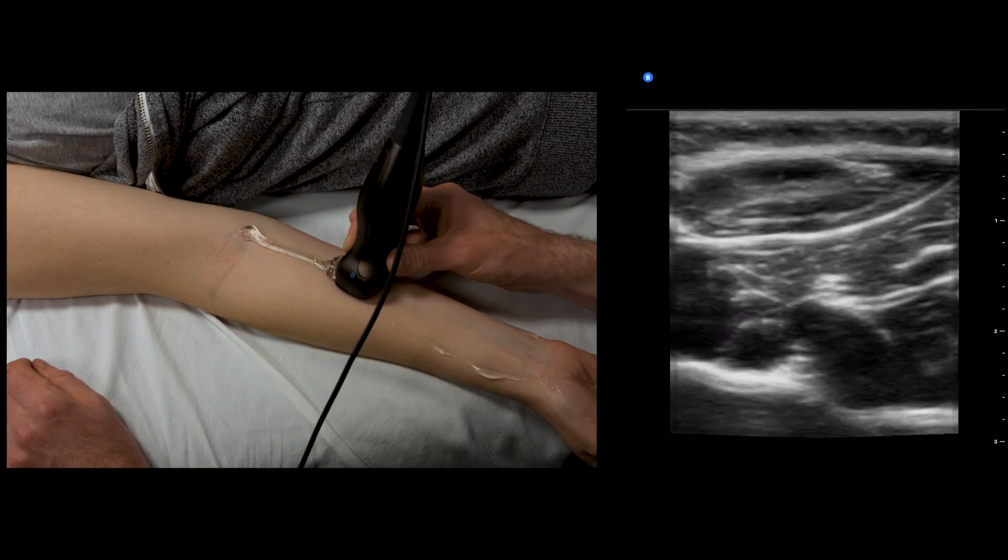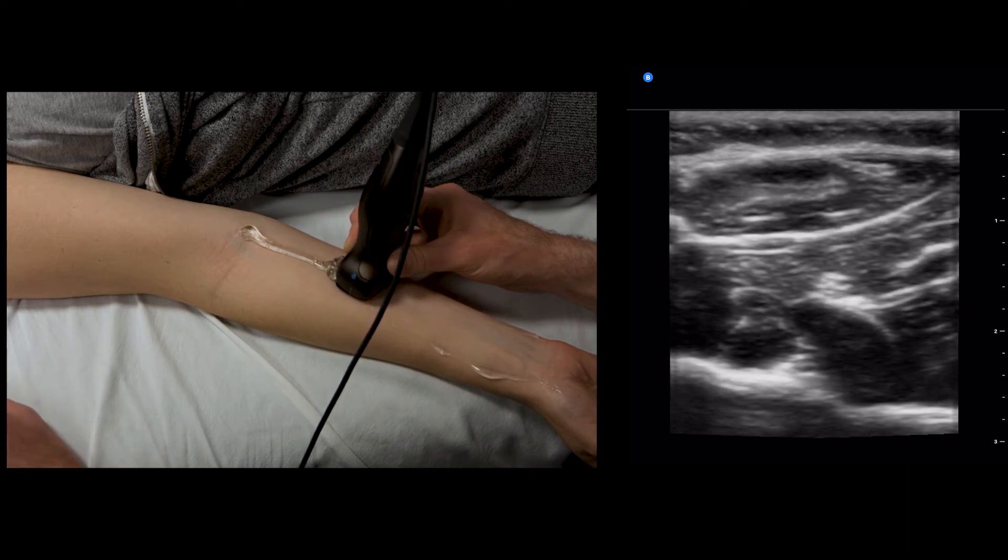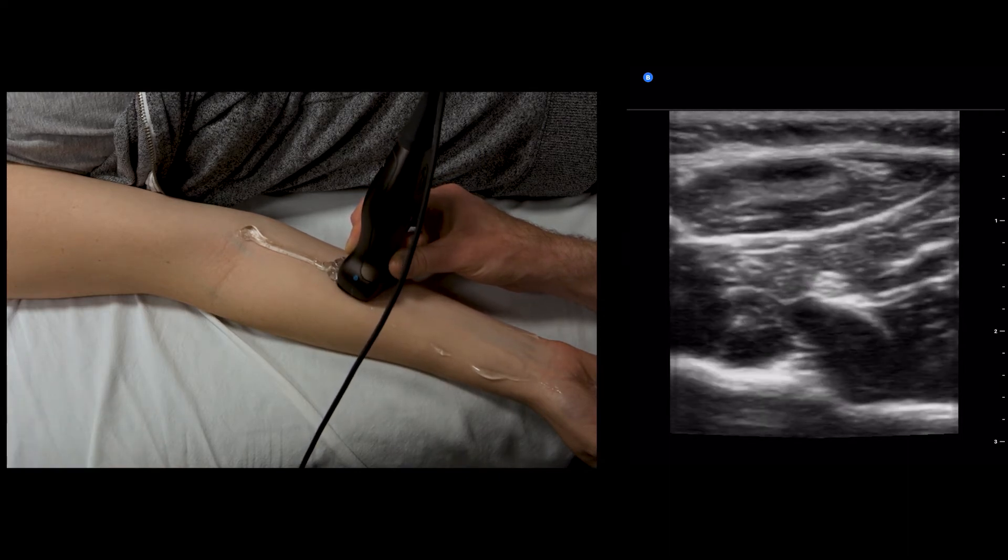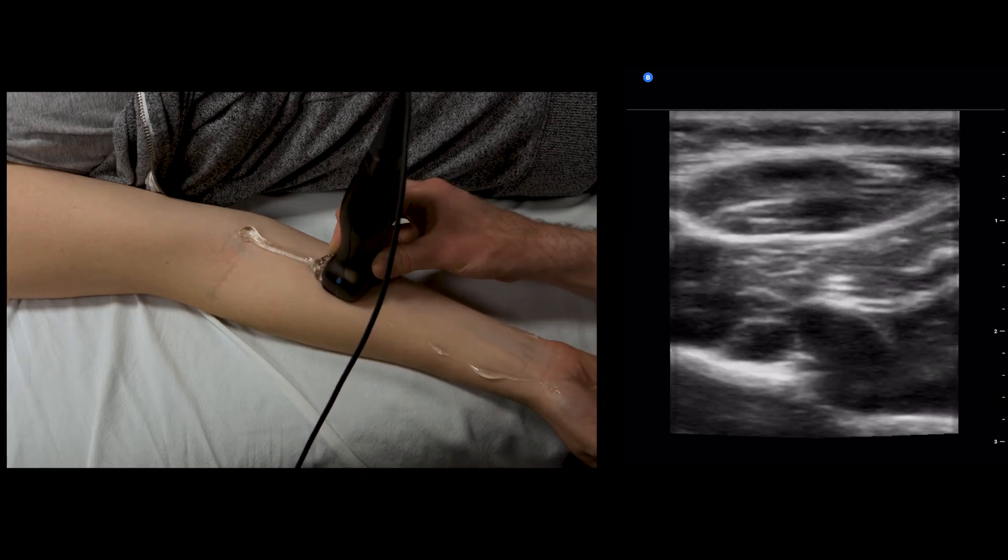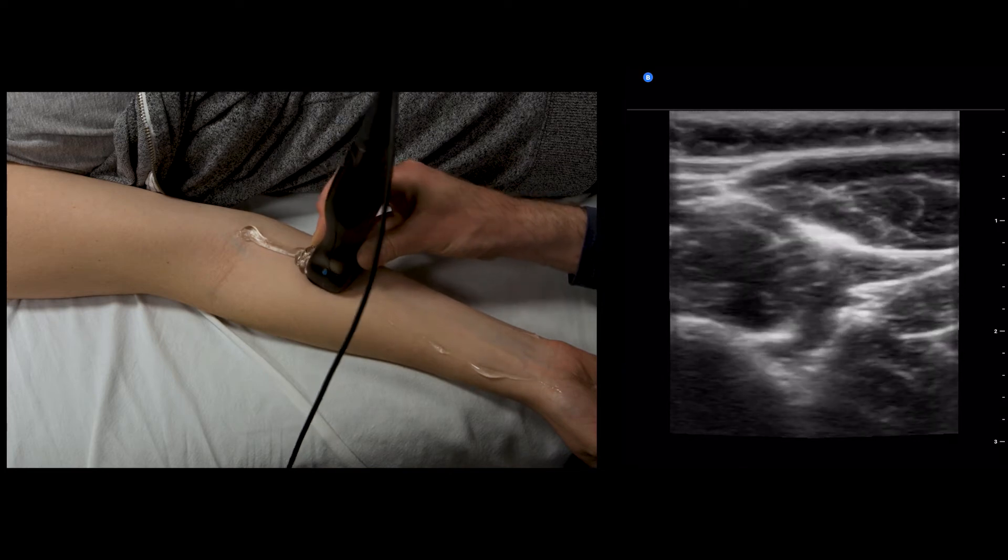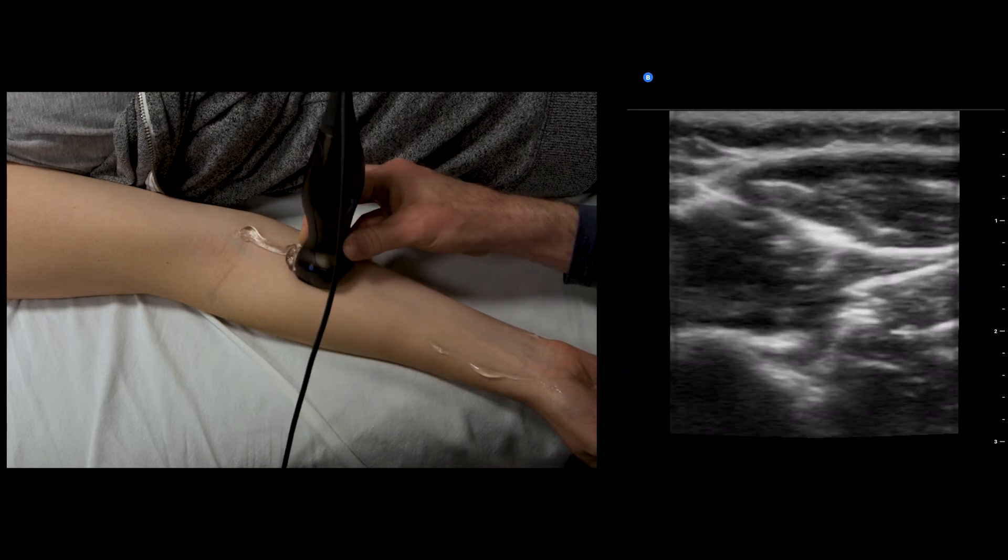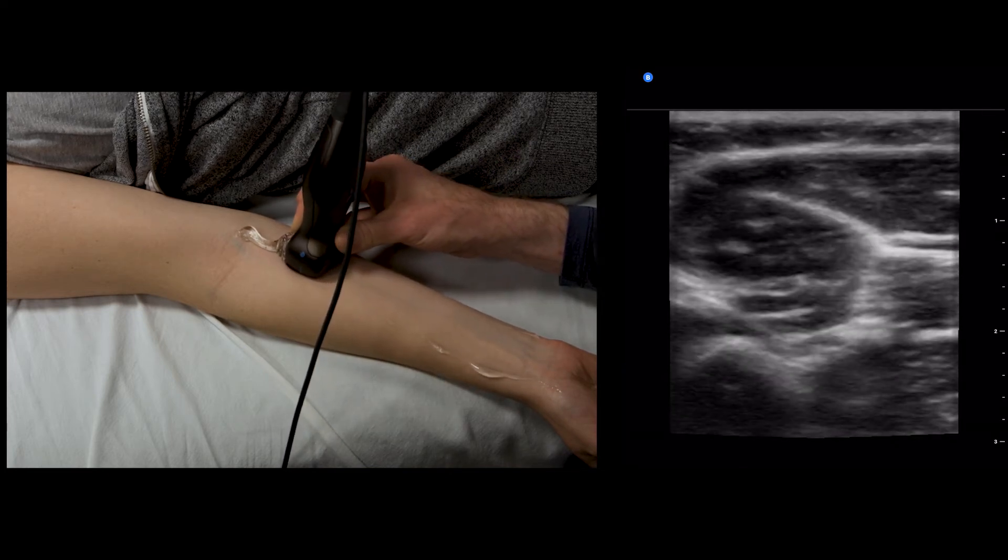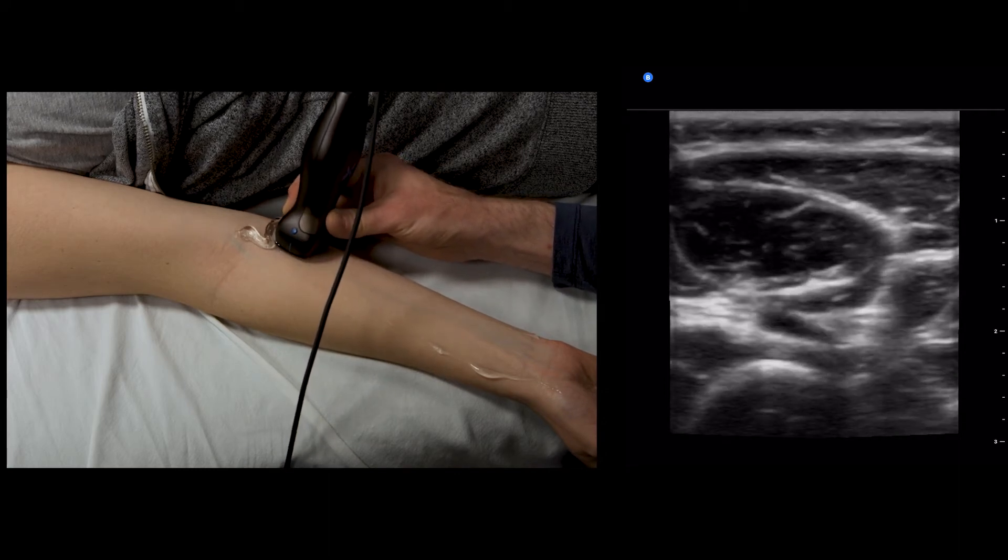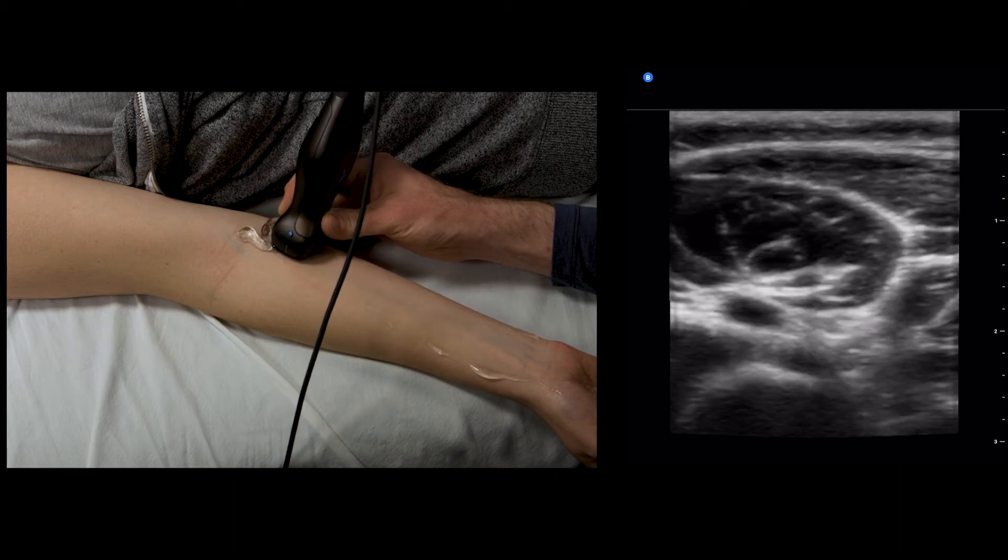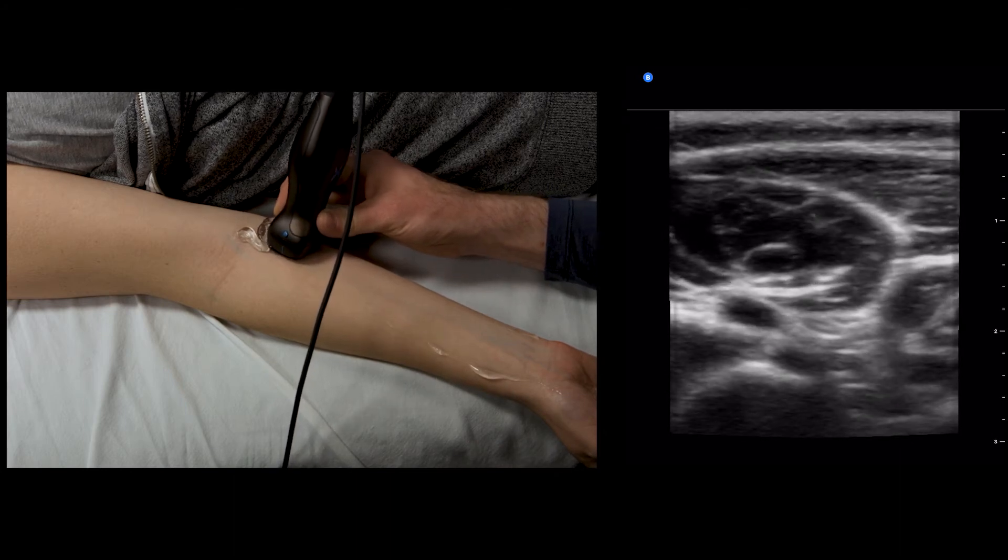The anterior interosseous nerve is just to the left or radial to that artery. We can follow the anterior interosseous nerve proximal, and it joins up with the median nerve here in the medial aspect of the proximal forearm.